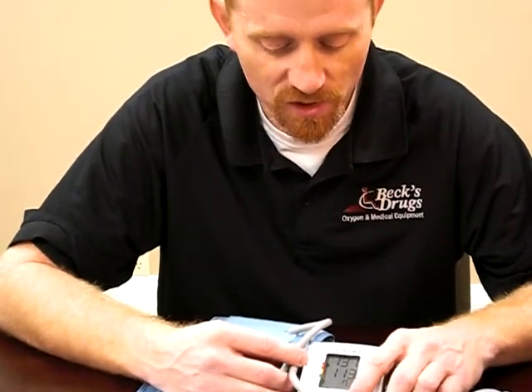Then you just need to shut your machine off when you're finished. Make sure you always have a fresh battery. Log your blood pressure on a log sheet if you need to, to keep track of it. And if you have any other questions, you can always give us a call.